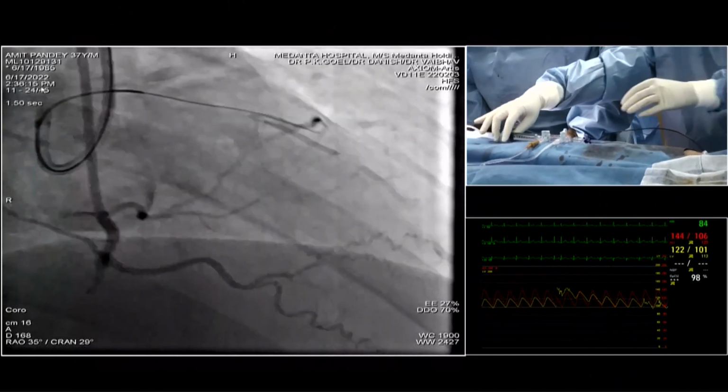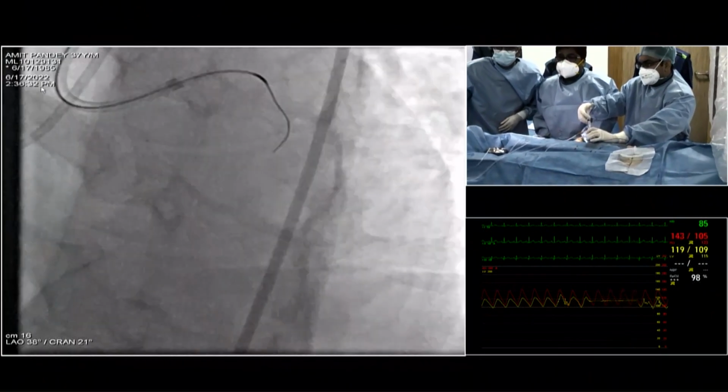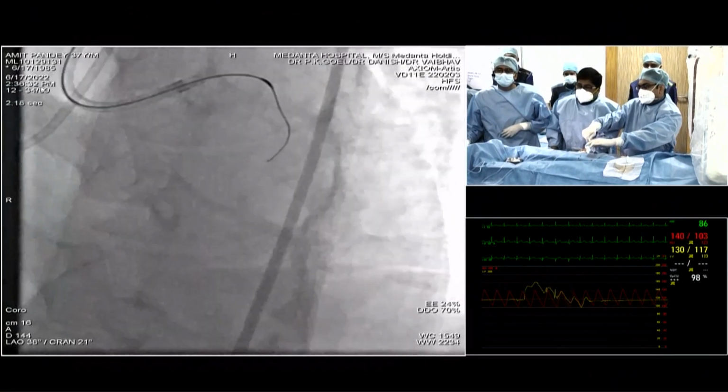So this will be interesting. So what will be your next step, Dr. Surya? What would you do? Whether you go ahead with a parallel wire with a dual lumen catheter, that's ideal, not to have subintimal for the two lumen type of the main vessel?